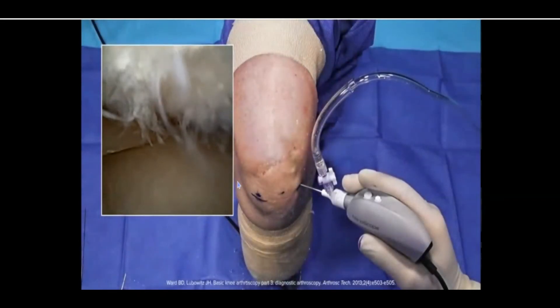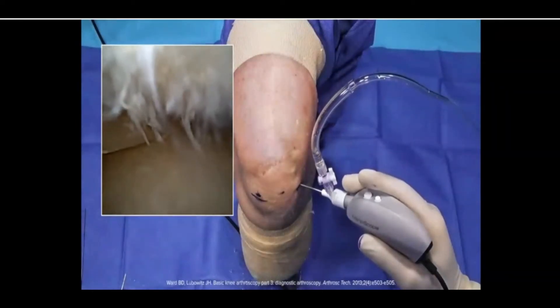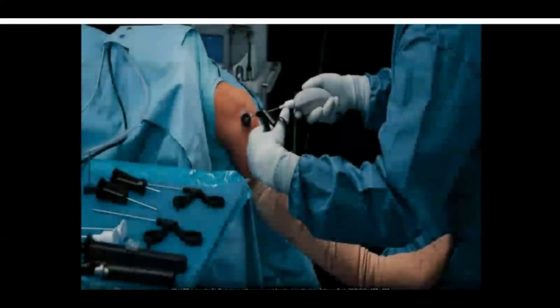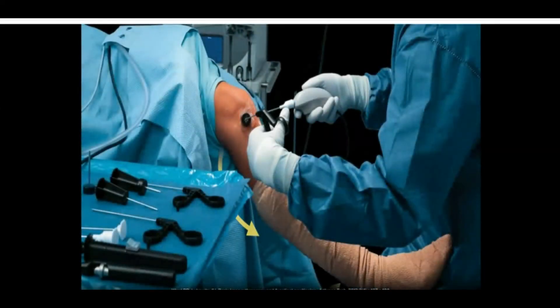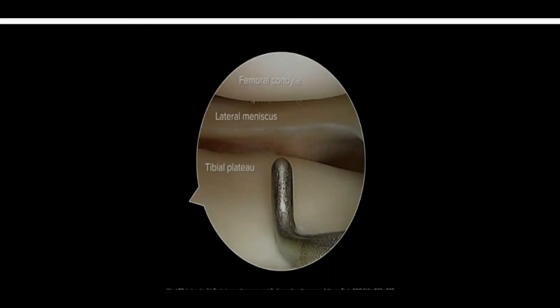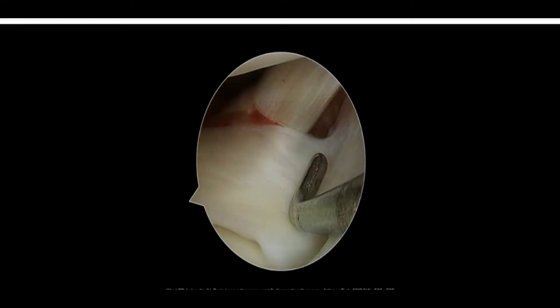Then visualize the lateral compartment through the medial portal. To facilitate this, the knee may need to be brought into a figure-4 position, or the surgeon can apply mild extension and varus stress against the leg. The lateral meniscus, femoral condyle, and tibial plateau are all evaluated. In the posterolateral corner of the knee, the popliteal hiatus can be visualized — this is normal anatomy and should not be confused with a meniscal tear or capsular issue.